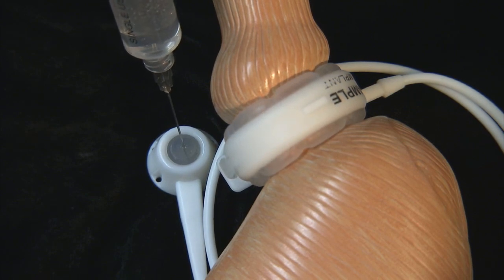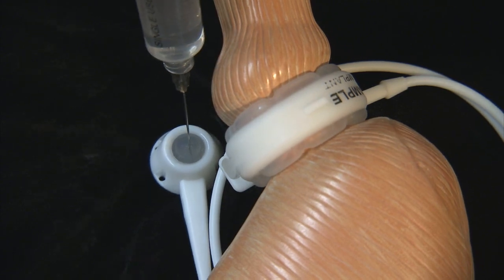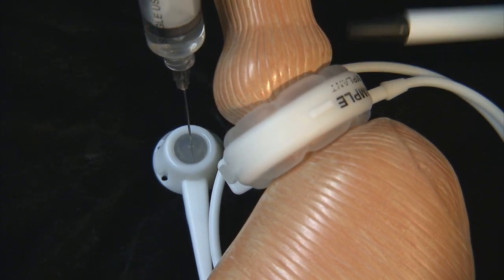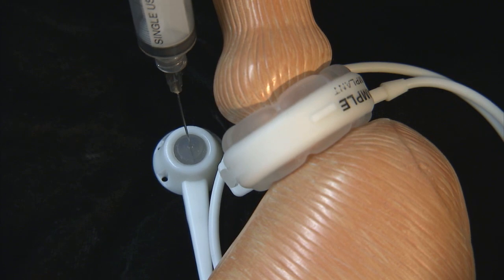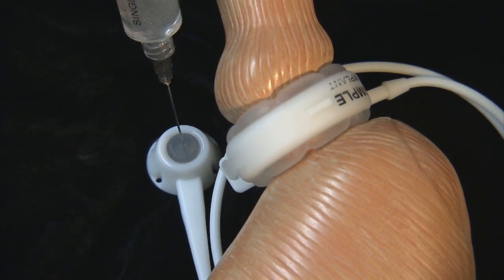Now it's being deflated. And one more inflation — you can see the balloon being enlarged. And deflation.